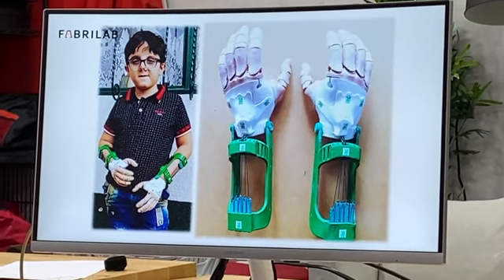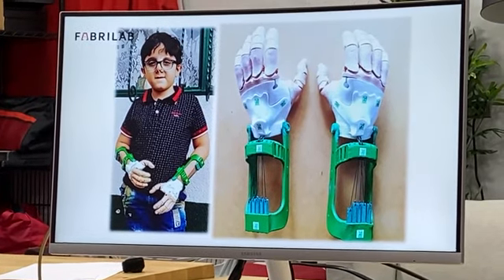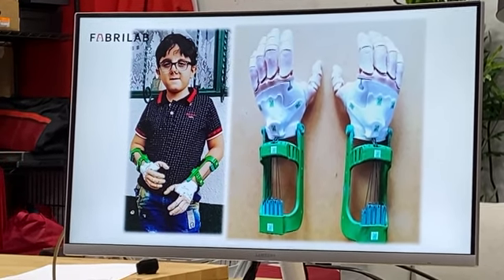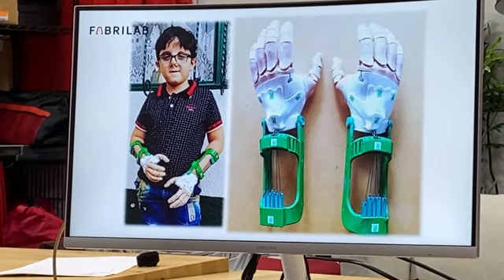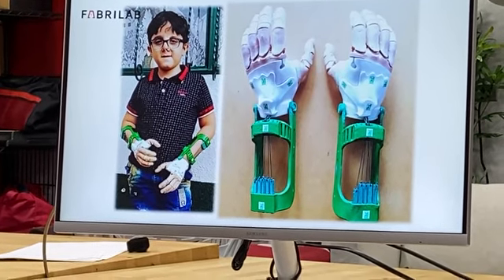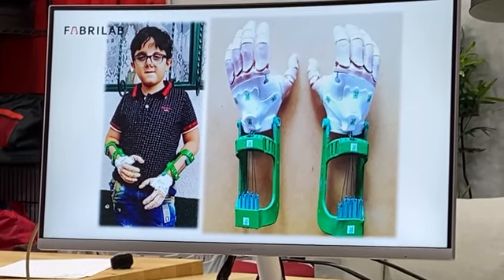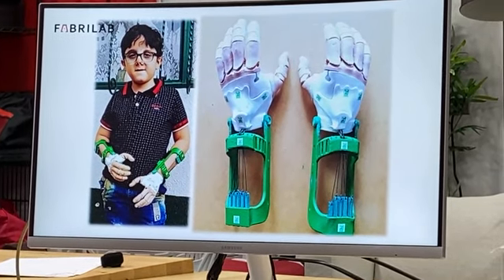That is the result of the feedback of the children, who suggest what to change, right? We started with a stiff wood design. Yeah, the Flexi hand too, right? We started with that, and we realized that we could improve many things on that design. So that's why we are using our own design that we already shared with the community 1 year ago, sorry.